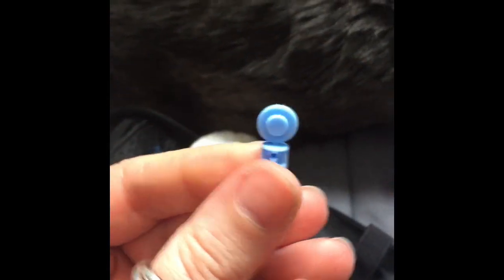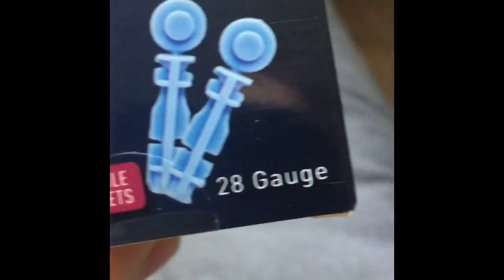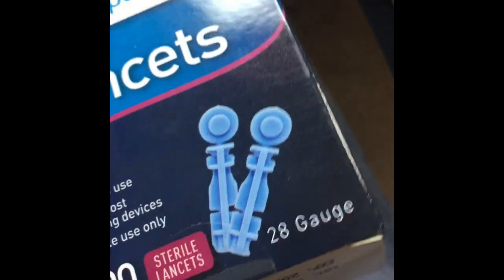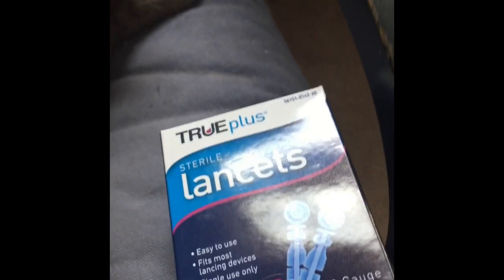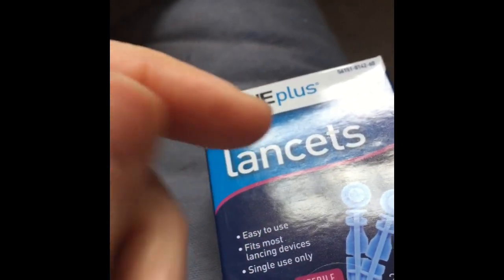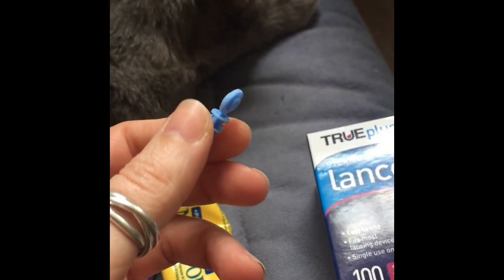This is the lancet. You want to get a 28 gauge or 26 gauge. If you get a human meter, sometimes they'll come with 31 gauge and they're a little bit smaller. The bigger the number, the smaller the point. So the bigger points are actually better, especially when you're first starting, so that you can get a drop a little bit easier.